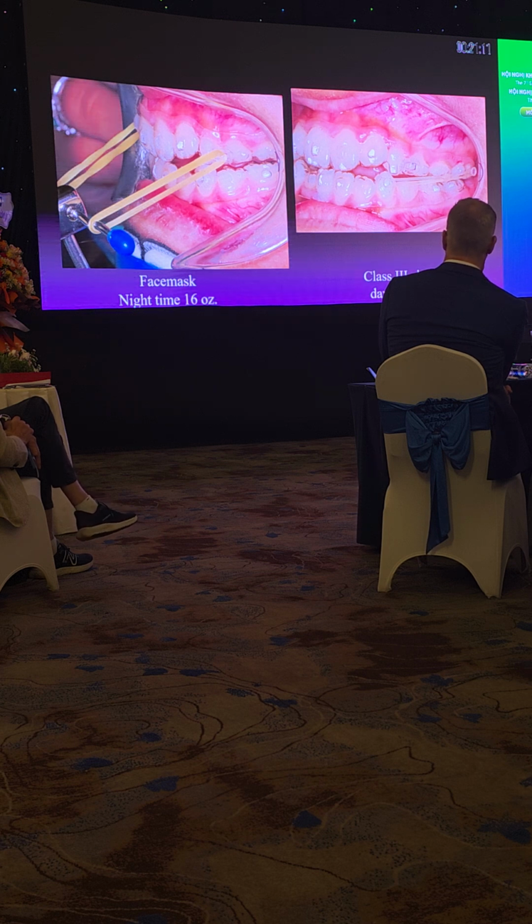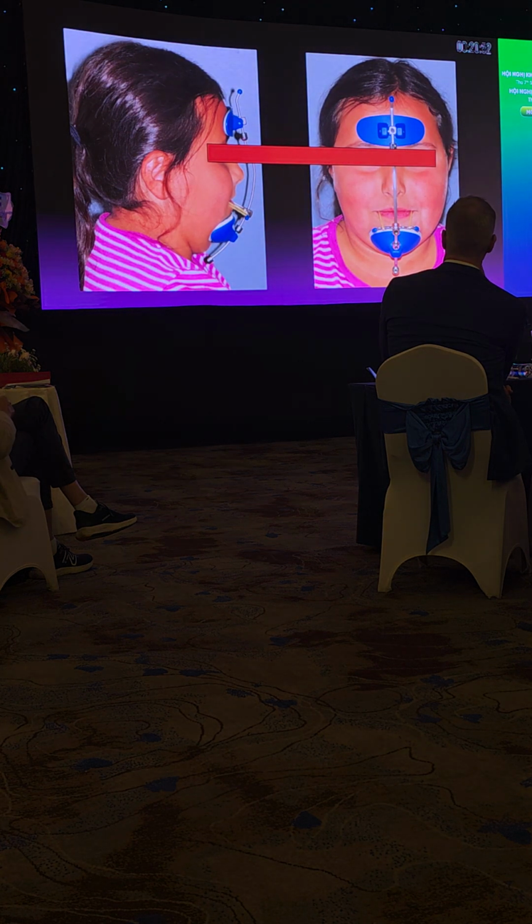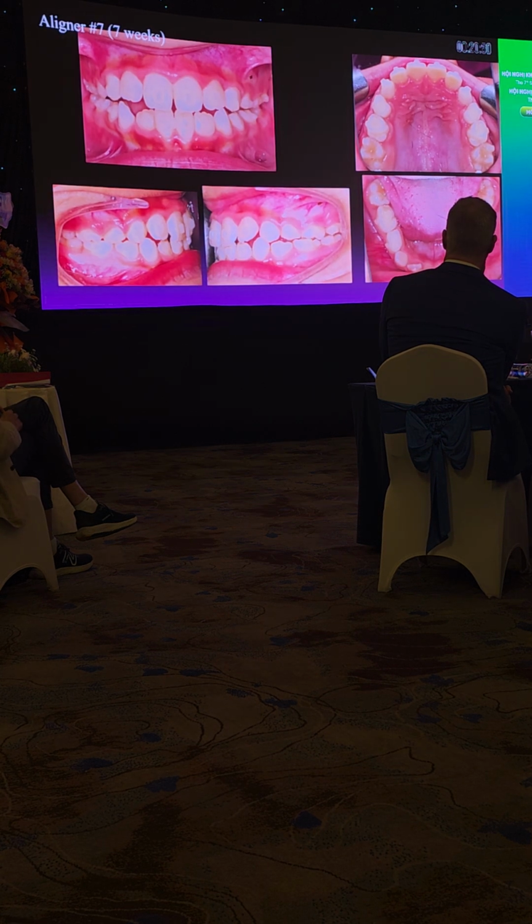You can put it in there for nighttime connecting to the face mask, and then daytime class 3 elastics. Oh, isn't it cool? You know, just add a few buttons in there. You can try it, right? So does it work? Check it out. Okay, so nighttime face mask and then daytime elastic.